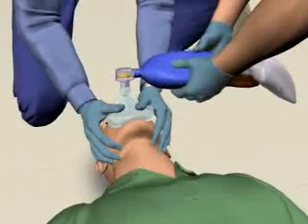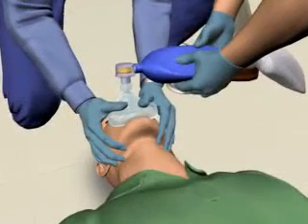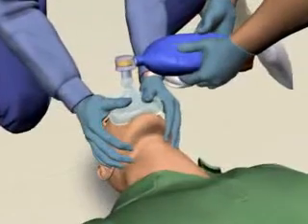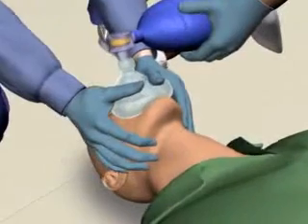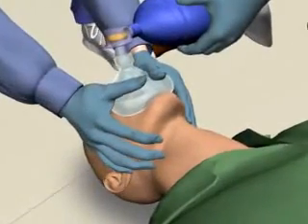To perform a nasotracheal intubation, direct your partner to ventilate the patient while you gather your equipment and supplies needed for intubation. Once you have all your supplies ready, instruct your partner to stop ventilating the patient.